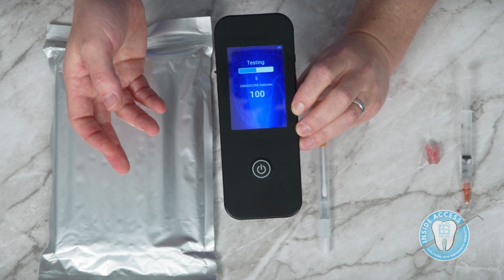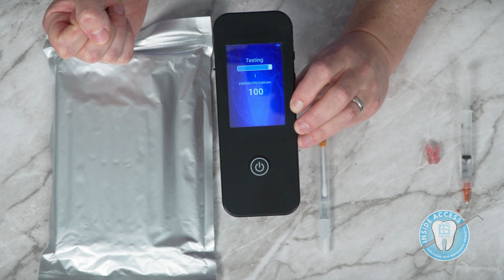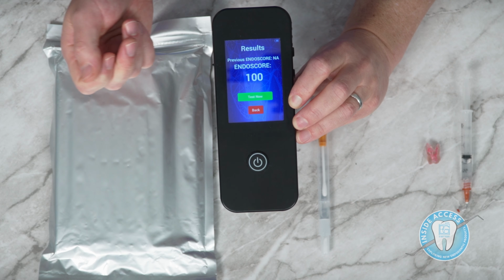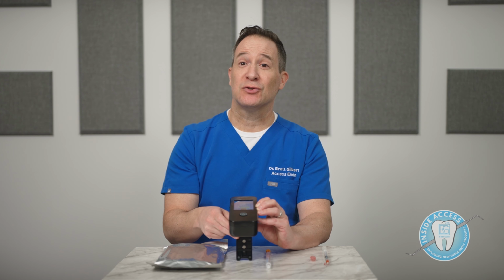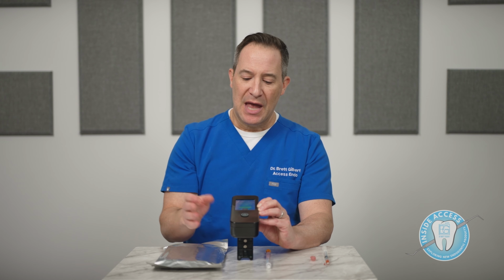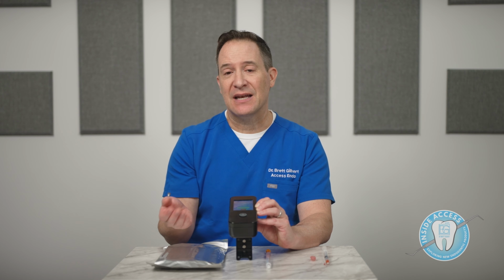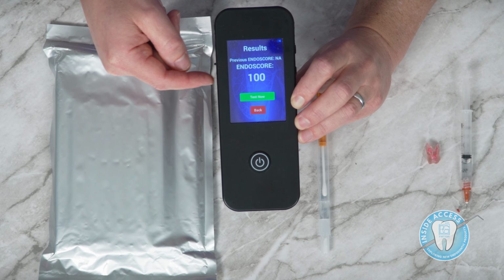This endo score scales from 0 to 100. You can see here, it's giving me a pre-score of 100, and it's giving me a score of 100. And why? Because I swabbed the bacteria directly from my mouth. So it's extremely accurate, and there is a scale that will help you determine if the canals are clean, maybe contaminated, or considered actually dirty. This will allow you to indicate whether you need more disinfection, more treatment time, more time with solution in the tooth. Really an incredibly valuable tool.